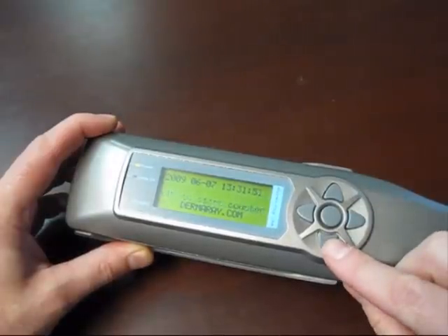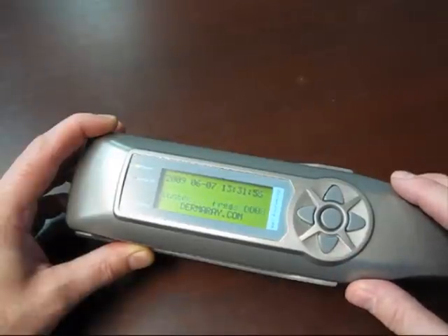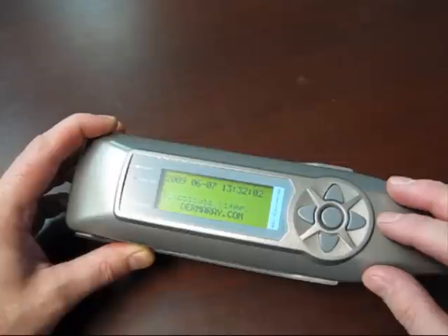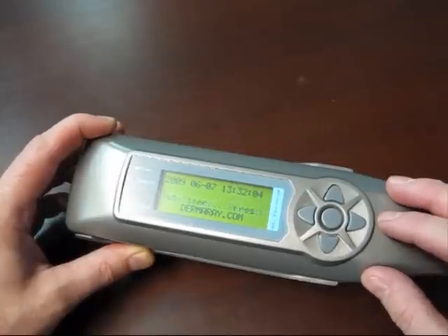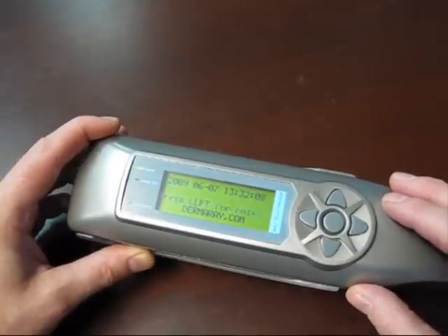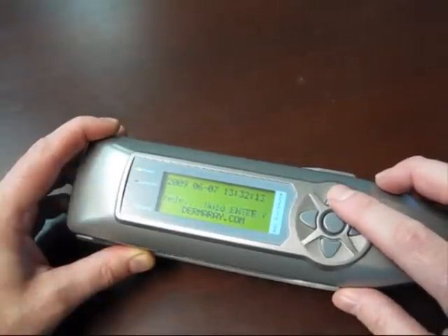Holding down the bottom key or the down arrow for 3 seconds will turn the lamp on for a predetermined amount of time. For example, if 100 seconds is selected, it'll turn on, count down 100 seconds, and then switch off. Just to run through all those features, if we want to turn the lamp on just like a traditional ultraviolet lamp, simply hold the top key down for 3 seconds.